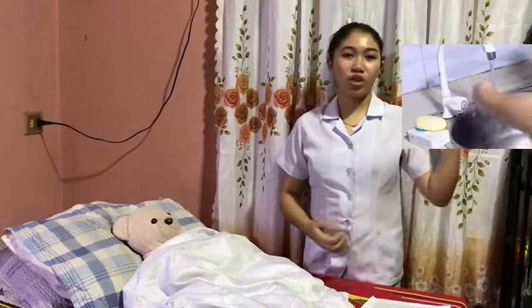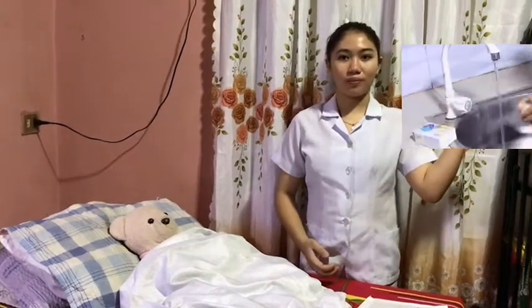I will assist you. Do the aftercare of the equipment used, and always remember to perform hand washing after doing the assessment. For the documentation of the urinary catheterization, document the size and the type of the catheter used.